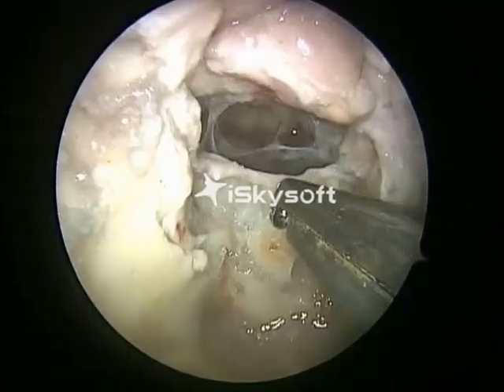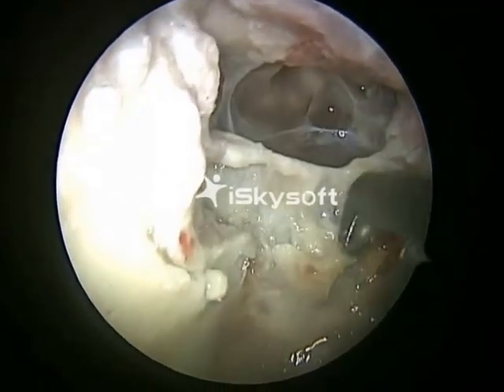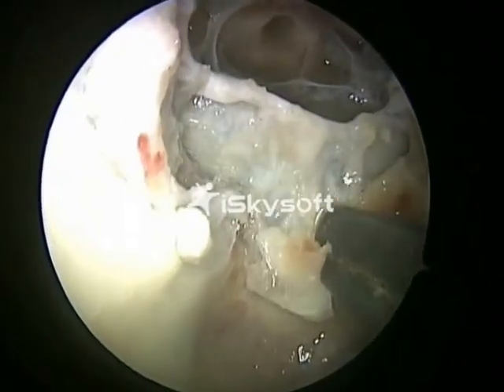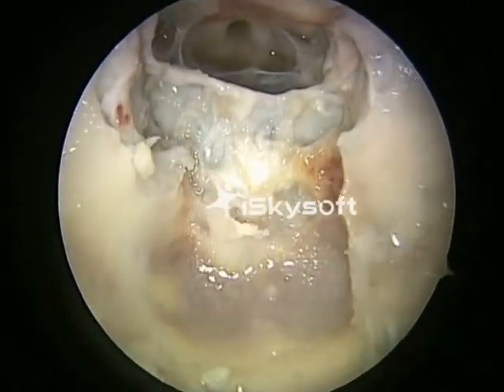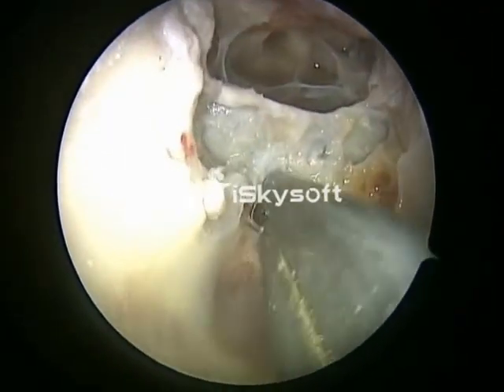And for that, adequate bone should be removed. The lateral limit of dissection would be the paraclival carotid and the Vidian nerve above, the medial pterygoid process below, and the eustachian tube below.